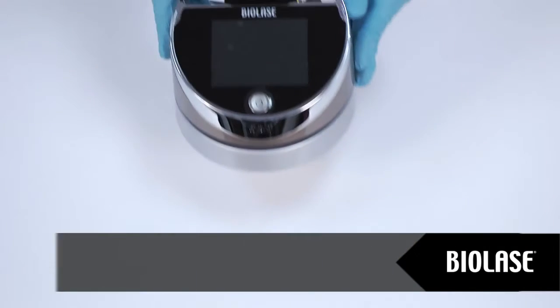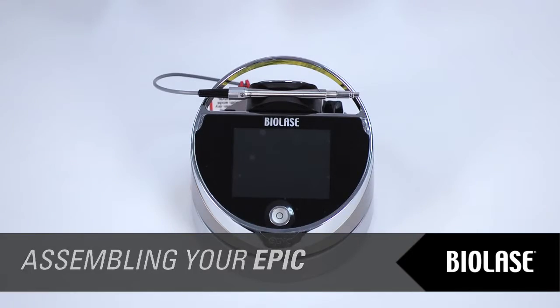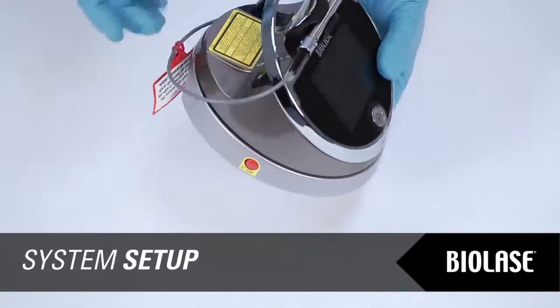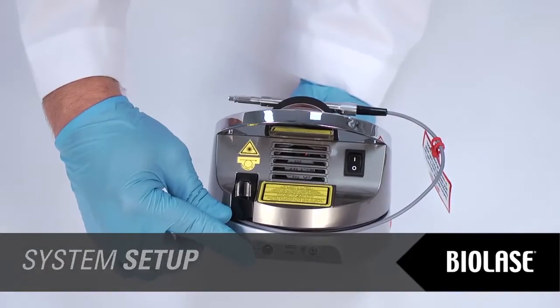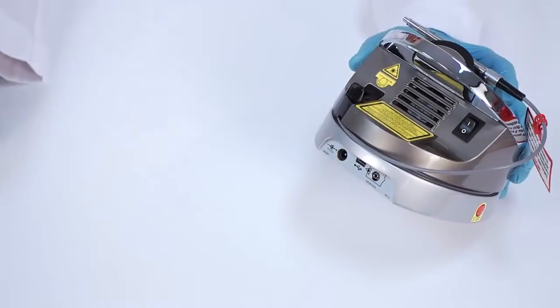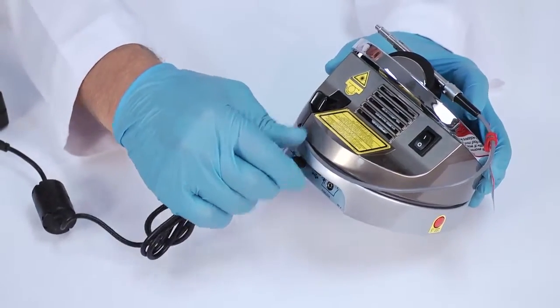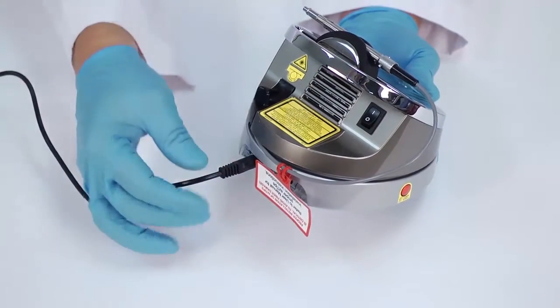Place the unit in a clean, dry, and well-ventilated area. Verify the power switch is in the off position. EPIC will operate using either DC power or a rechargeable lithium-ion battery pack. To use DC power, connect the power cord to the laser console and plug into a wall outlet. To use battery power, you must first fully charge the battery.